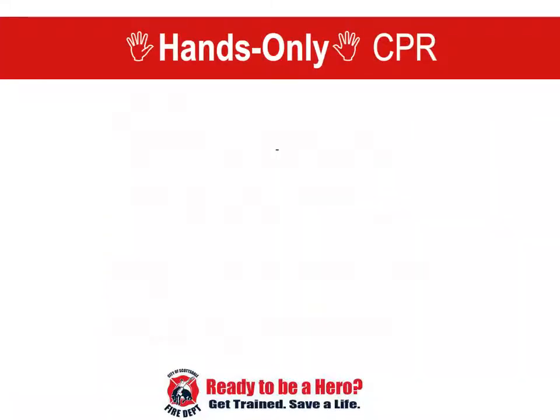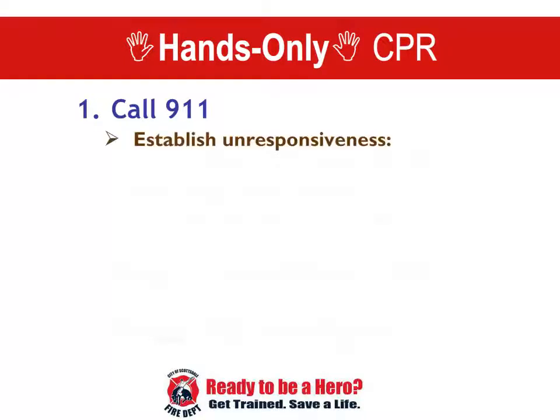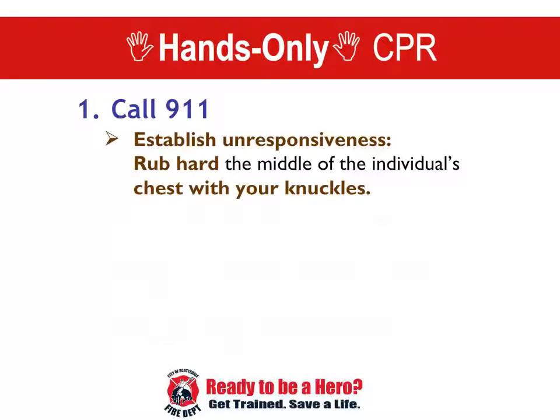Remember, the first step is to call 911. If you are in a group of people, don't just yell out, "Call 911." Instead, point to a person and assign them to make the call. Otherwise, people may stand around hoping someone else will make the call. Check for responsiveness by doing the sternal rub. Assign someone to go find an AED and bring it back.